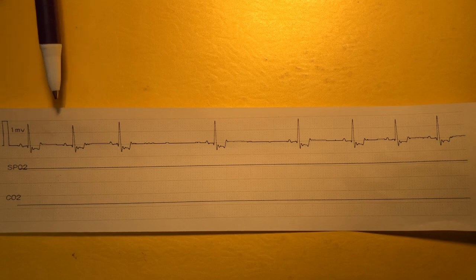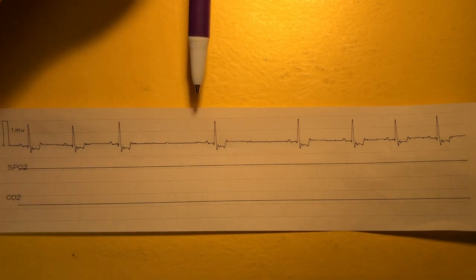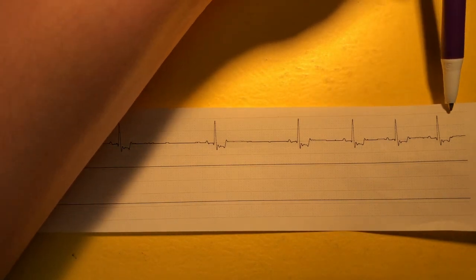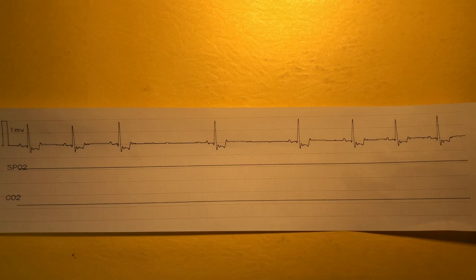So we see 3 QRS complexes, some lag time, another QRS complex, another one, and then another grouping of them here. What this tells me is that since we have a regular pattern of irregularity, we have a sinus arrhythmia going on. Another thing we want to look for is to be sure that for every P wave we have a QRS complex, and for every QRS complex we have a P wave. As long as we have that, we have a sinus rhythm going on. If not, we could have some sort of arrhythmia going on.